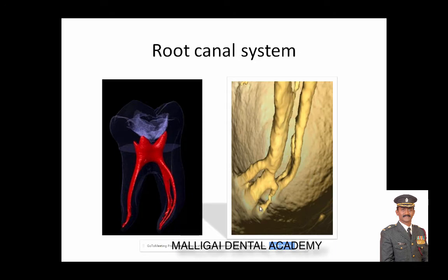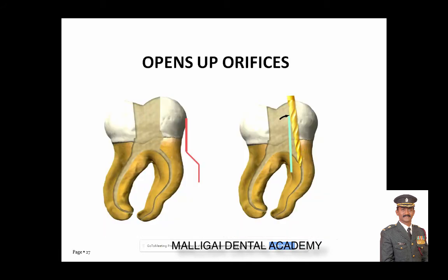And how do you think we are going to clean this root canal system? Simply by addressing the one principal canal with one single rotary instrument? We cannot do that. Therefore, when we use the crown down protocol, we are basically making space for the irrigants to enter the root canal system, because it is the irrigants which are going to clean the entire root canal system. They will reach the areas where no rotary file or no hand file can ever reach.